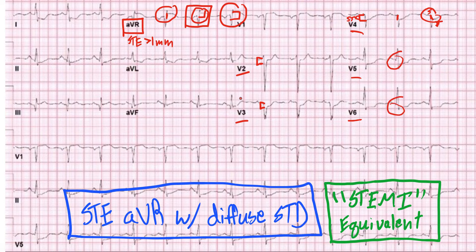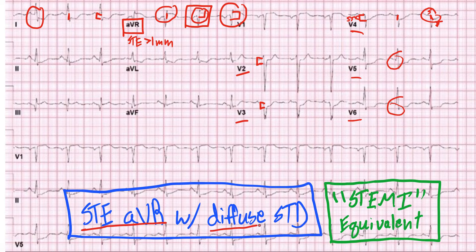Then you can even go over to your limb leads and again see ST depressions there — we're looking at the segment right there, right there, all that ST depression. So in this EKG, you have someone with ST elevations in AVR and diffuse ST depressions throughout.